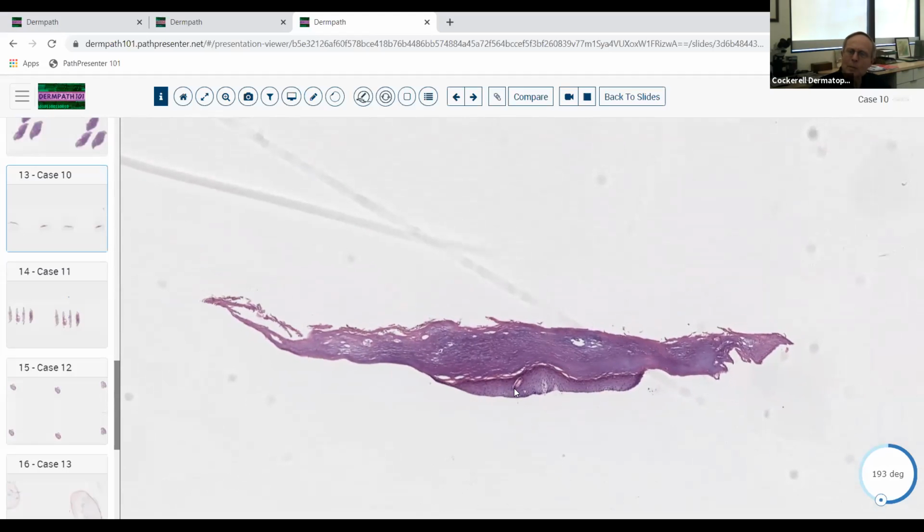Now, this has a teaching point. So what part of the body are we on? We're on volar skin. A lot of times when you biopsy somebody's volar skin, maybe they have something that looks like a melanoma or some acral nevus, and you say, well, I'm going to take a shave biopsy of this lesion, and I'm going to really do a deep shave biopsy, and I'm going to really get to the bottom of this thing. Well, this person took a pretty deep biopsy for them. They thought they were getting pretty deep, but they just barely got to the bottom of the epidermis. If we were going to measure this with an ocular micrometer, this might be almost a millimeter thick, but they didn't even get into the dermis hardly.